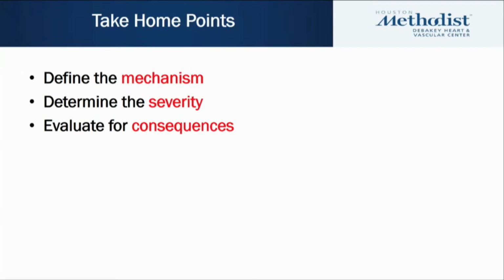So my take-home point is to make sure to determine the mechanism, the severity, and the consequences of each regurgitant lesion. It's like solving a puzzle. You want to get all the pieces and you want to understand that each method has its limitation.